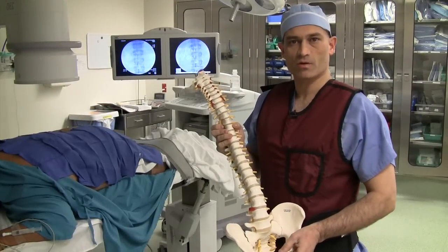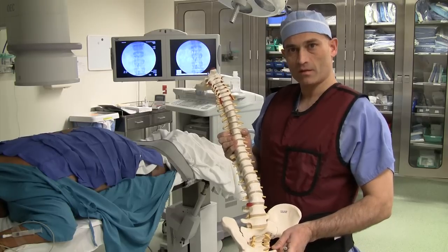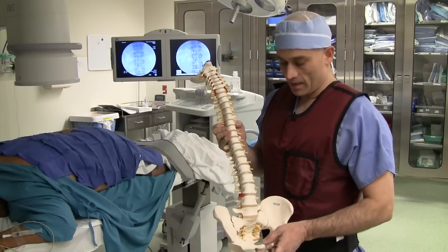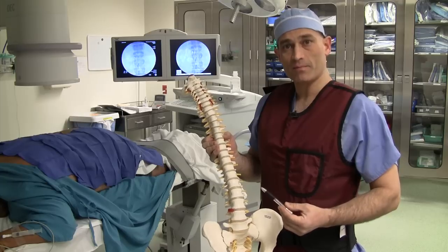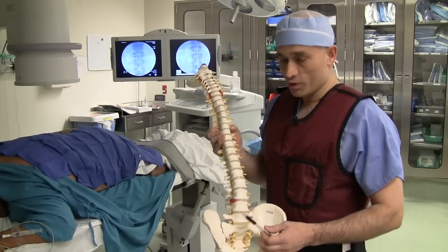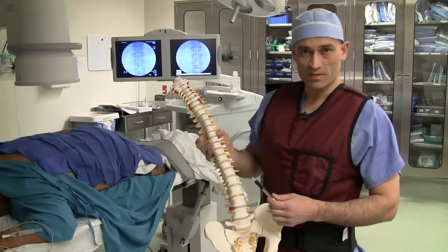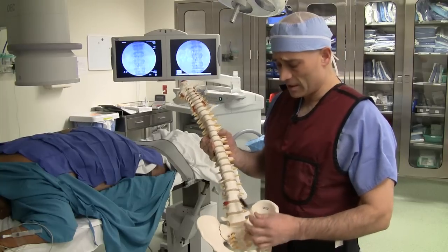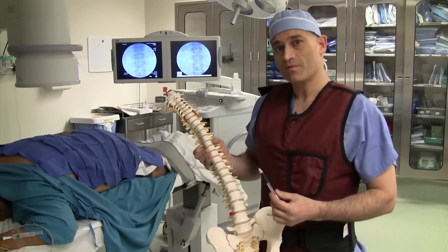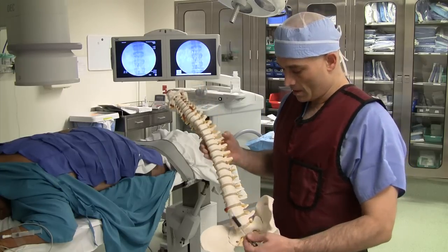Hello, I'm Dr. Richard Cole with NJSR, and today we're doing a transforaminal epidural injection. The procedure is used to help people with herniated discs and nerve compression, which can lead to back and leg pain. And what I'd like to do is to use this plastic spine model to demonstrate some of the anatomy and some of the details of the condition and the treatment that we're going to use.